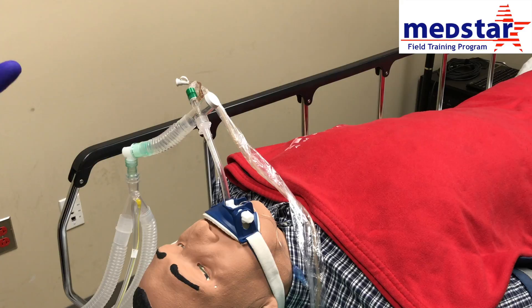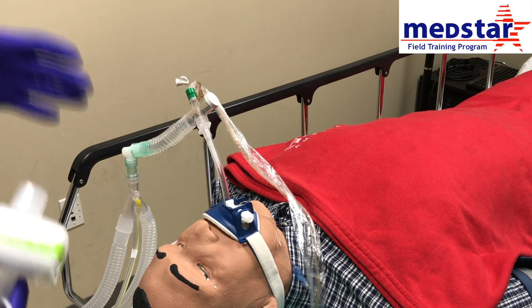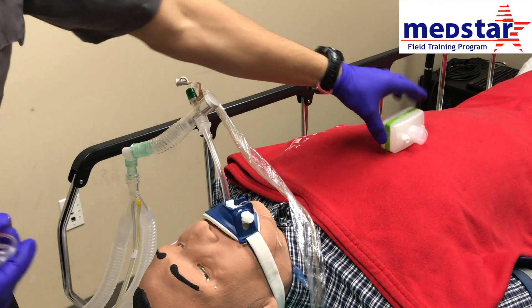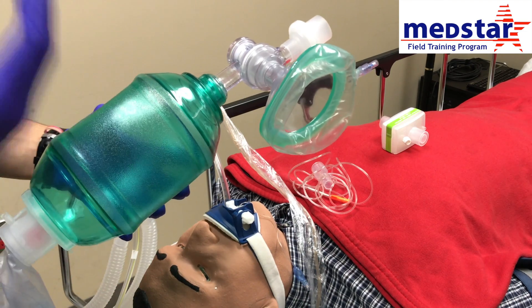Now that we've obtained all of our settings from respiratory and inputted them into our ventilator, we're going to hook our patient up to the vent. You're going to need your HEPA filter, your capnography, and your BVM as backup just in case.